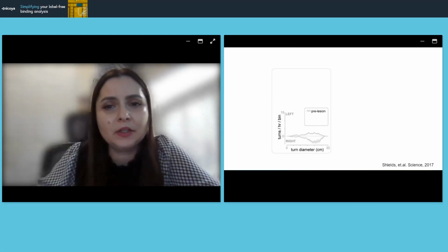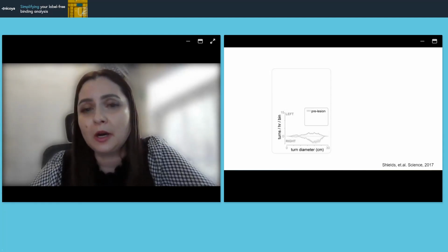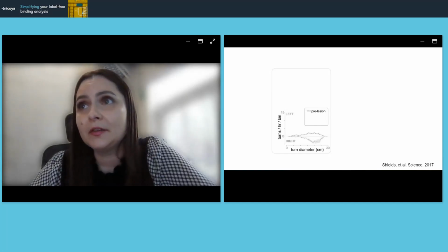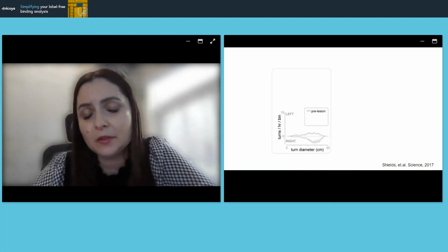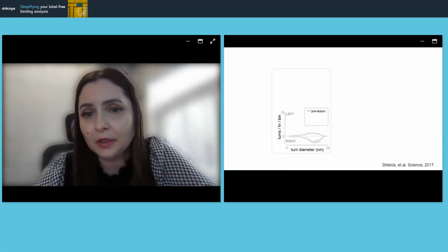Okay, and here is the summary of the videos with different animals that you saw right now. We first performed the surgery of the two cannula insertions, and then quantified the locomotion and the turning. As you can see, it was still able to turn left and right, and it made a pretty wide turn diameter.